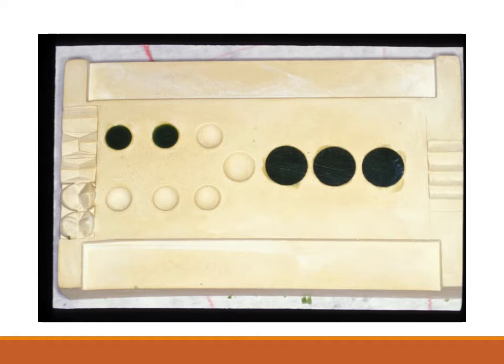Simple as this looks, it will be one of the more difficult projects you will be doing because of how detailed and smooth you will need to make this. In practice, your dental restorations will require you to both carve down and build up your materials in restorations in order to achieve a fully restored tooth. So the skills you learn here are a part of your foundation for understanding and for learning your technique.